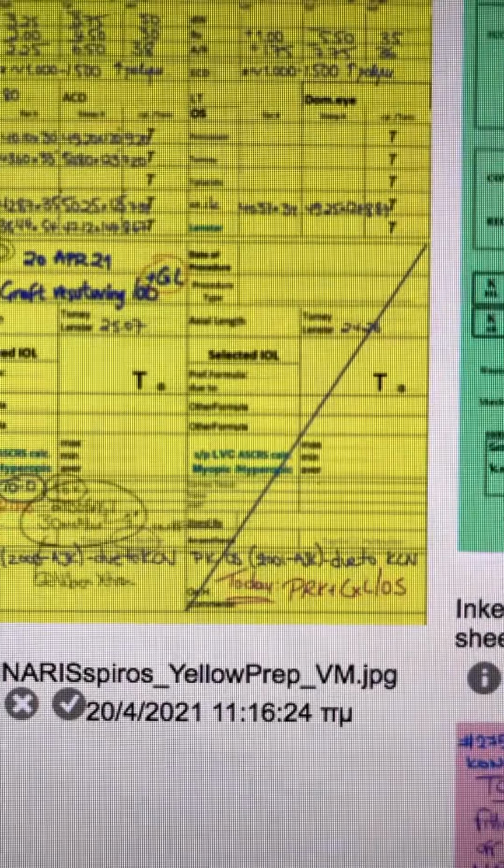And on the other eye, as I mentioned, this is the surgical report. We will re-cut the incision 360 degrees, place 6 interrupted sutures, soak with riboflavin solution, and then perform cross-linking. And we're going to see some of the intra-op images of our procedure here.